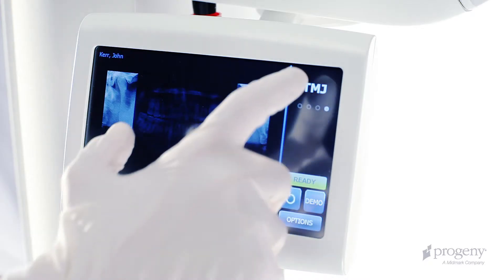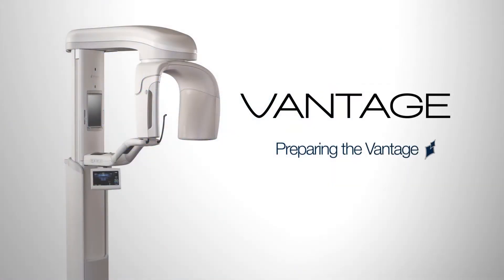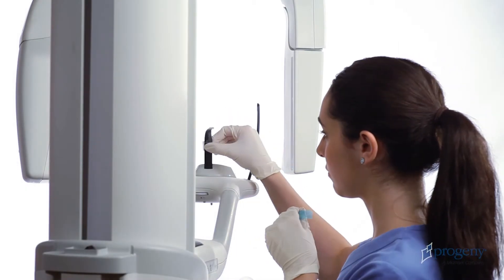Below the positioning table, we have the Vantage Touch operating panel. Before introducing a patient for examination, we must prepare the system.